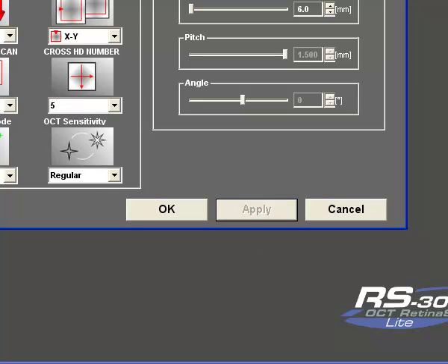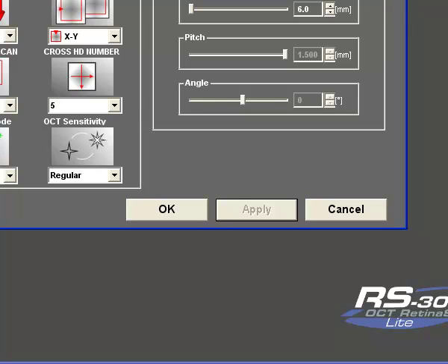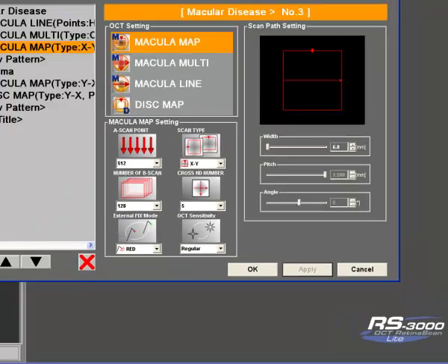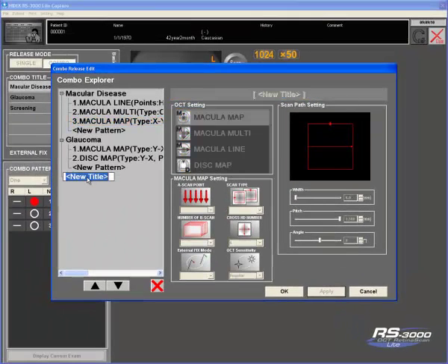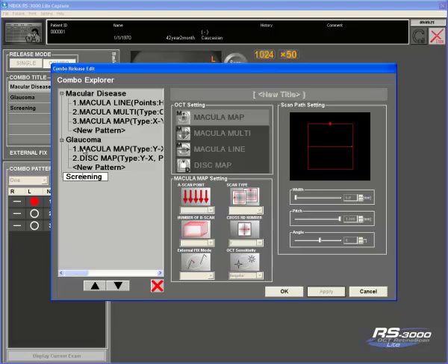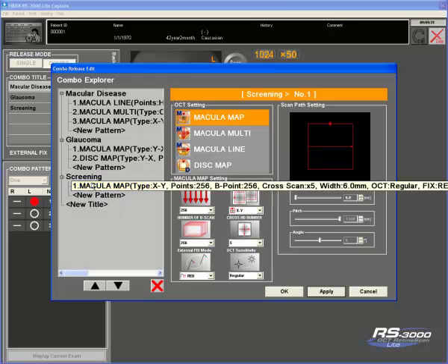To add a new type of combination, simply select the new title so that you can type, call it whatever you want it to be. For example, I am adding in a screening. So if I don't want to scan just the macula or just the disc, the screening scan will give me a macula and a glaucoma assessment. Type in screening or whatever you want to call it, hit enter.